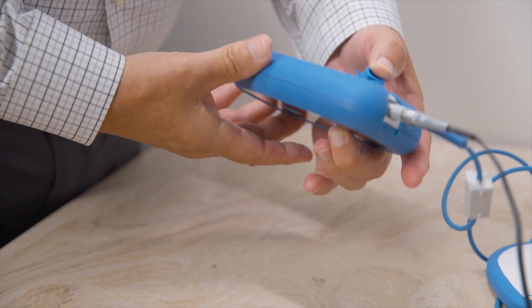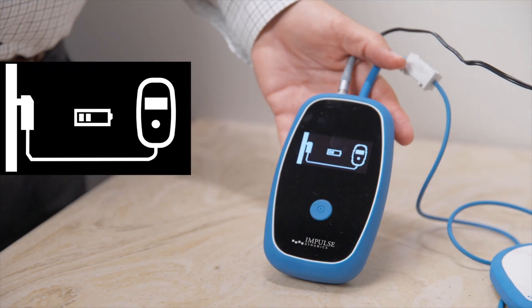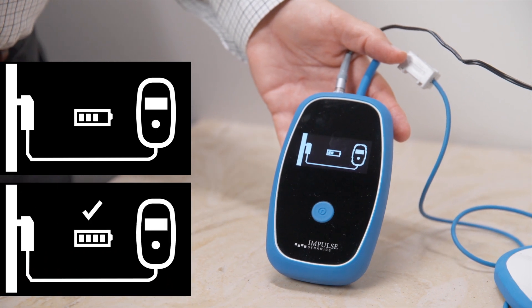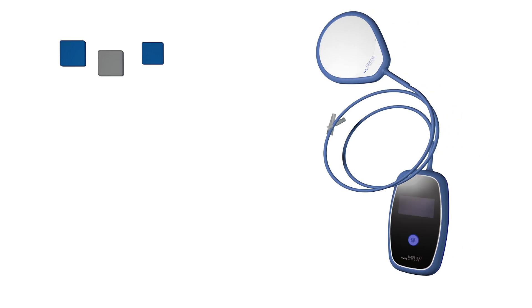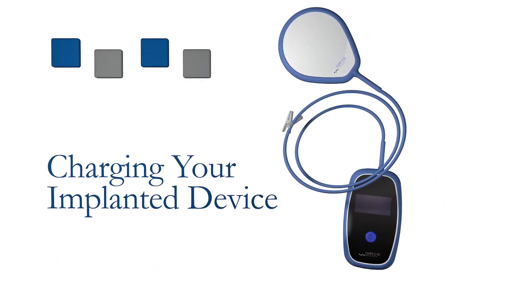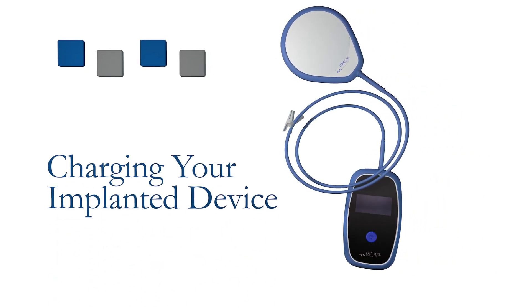When successfully connected, the display will show either a flashing battery icon or a check mark. The battery pack in the charger is full. Here is how to perform your weekly charging of the Optimizer device.